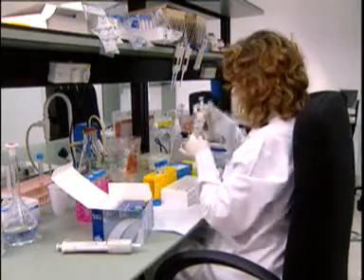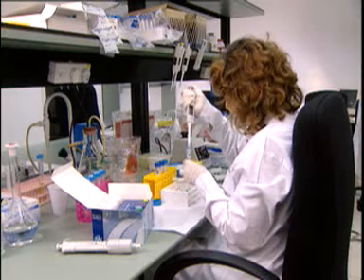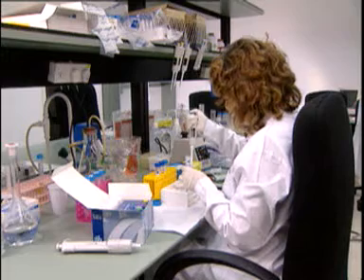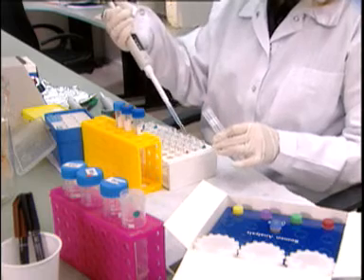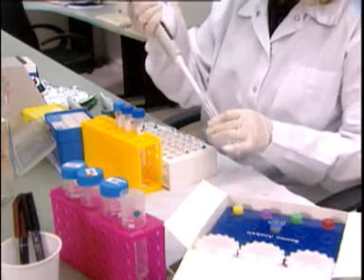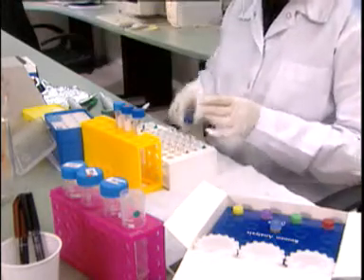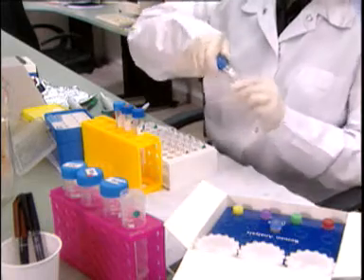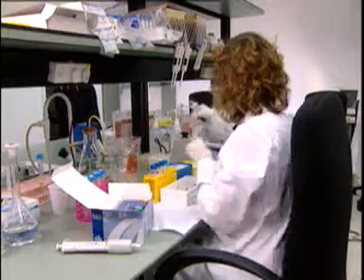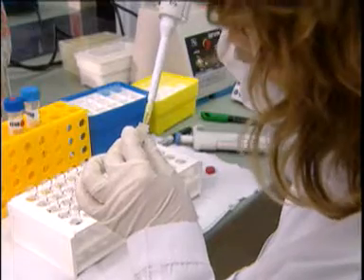First, the semen sample is diluted by a buffer and divided into a set of 7 tubes. A for control, B for motility, C for viability, D for counting white blood cells and the number of immature sperm cells, E for anti-sperm antibodies, F is for the morphology of sperm's head, and G is for sperm cell count. For tubes B to G, 10 microliters of a specific reagent is added. Reagent B to tube B, reagent C to tube C, and so forth.